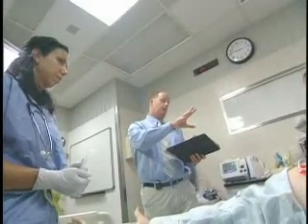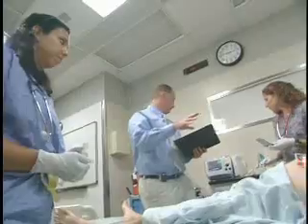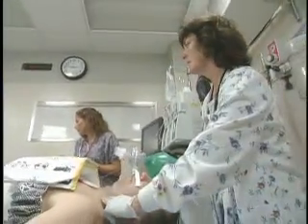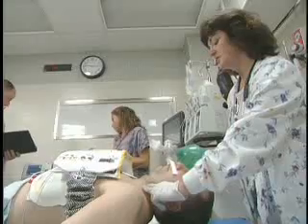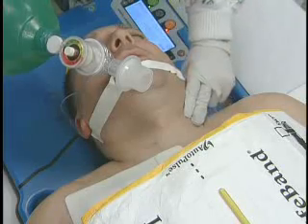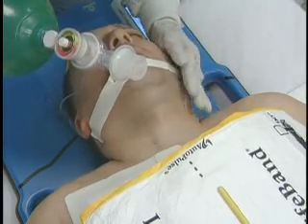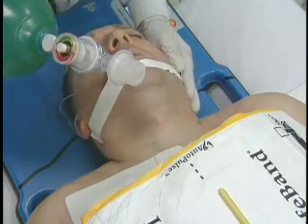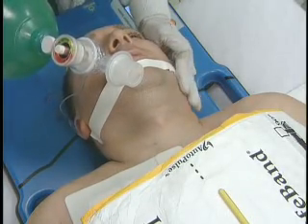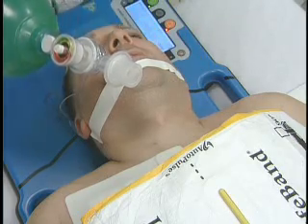Okay, why don't we go ahead and pause the auto pulse. Let's feel for any blood pressure, any pulse. The rhythm looks to be sinus. Does he have a pulse? We have a strong carotid pulse. Very good — you're okay, Mr. Spinetti. Let's get a second IV, check a blood pressure. I'm going to talk to the family — she should be in the waiting room.